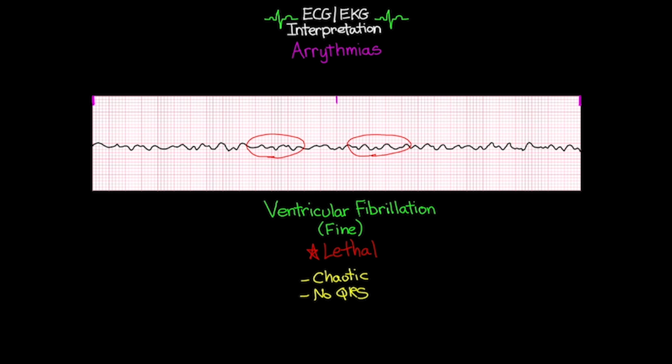All right, on that note, that is going to wrap up this lesson in which we have talked about our ventricular arrhythmias. So we've done a pretty good review of these various ventricular rhythms that you're going to see, from our IVR to our AIVR, and then progressing into ventricular tachycardia or VTach, and some of the different variations that you're going to see with that.